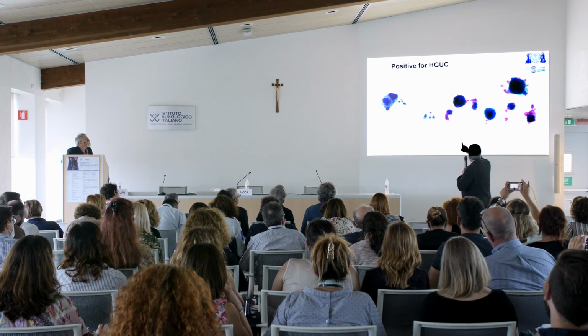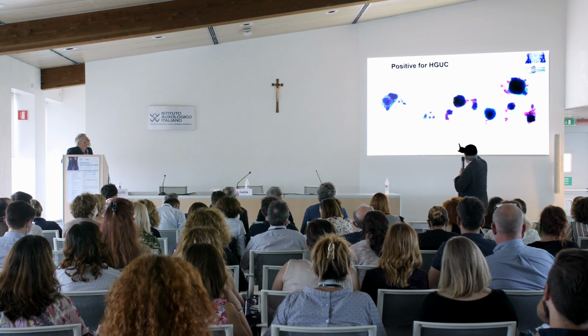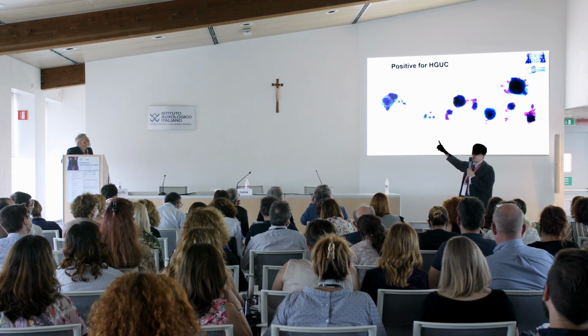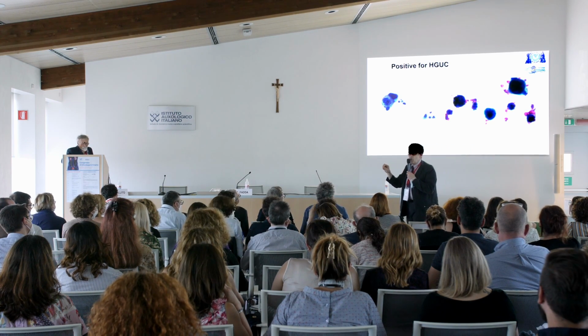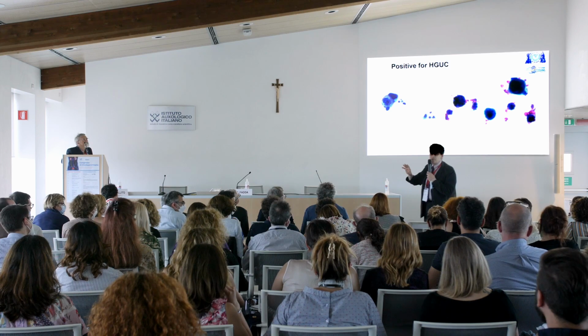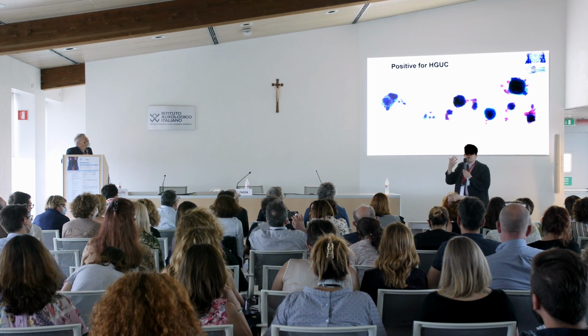In the picture in the middle, you have two cells. The upper one is a kind of apoptotic cell or necrosis of the nucleus, so you cannot say anything. But of course, apoptosis or necrosis is not good in urine, and this is also a 70-year-old man.